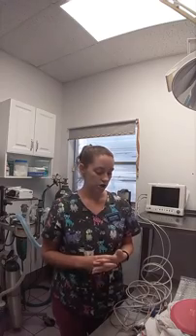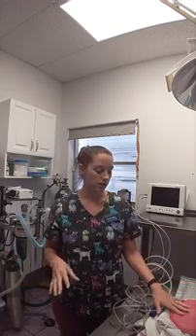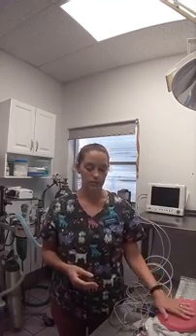We try to make sure that the patient is warm, but at the same time, like with the heating discs in their cages, they're able to walk away from them once they're starting to wake up, so that they're not against them for too long and getting too hot. So we continue to monitor them, making sure they're staying warm and at a comfortable temperature. Those are the monitoring devices that we have to use for anesthetized patients.